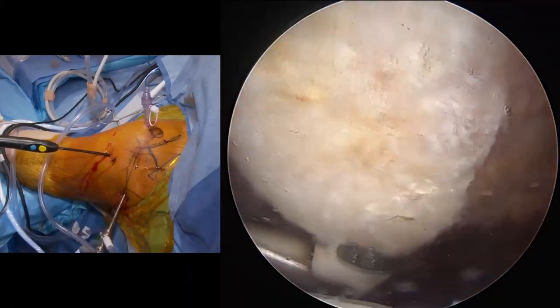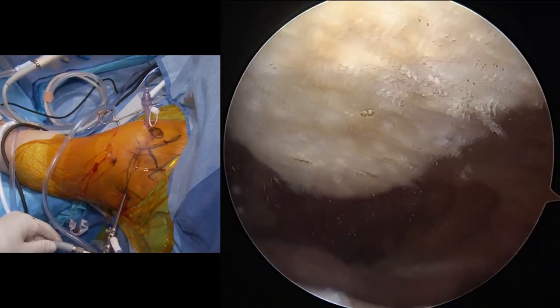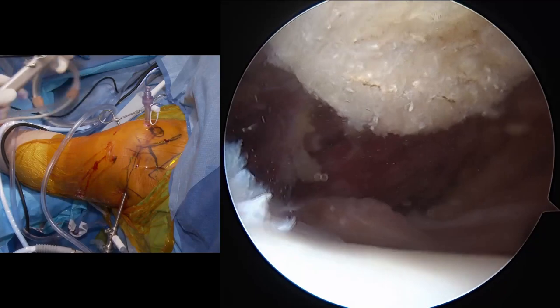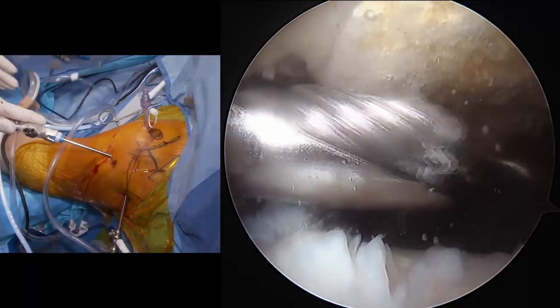Okay, so that's the edge of his acromion. Solid type 2 acromion there. So we're going to go ahead and clean that up. It's right on the area where we're operating, where we're trying to fix his cuff. So we're going to try to take that down a little bit.